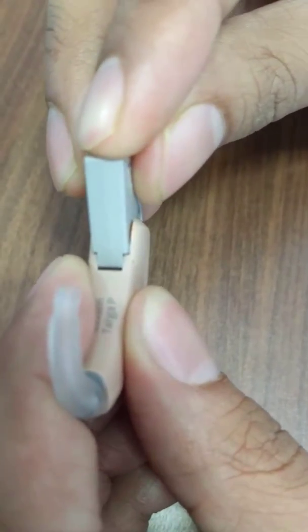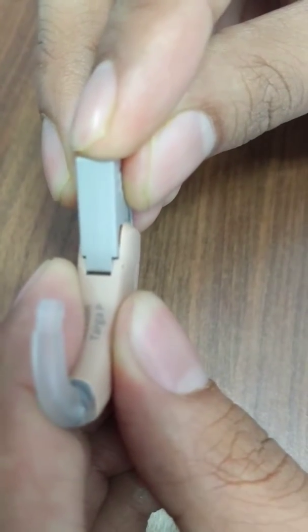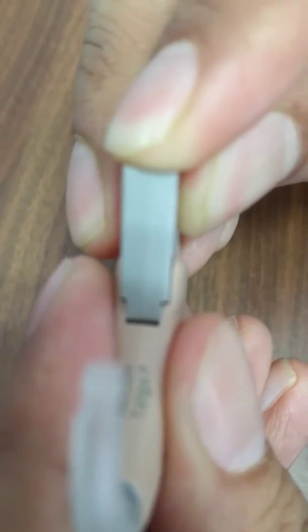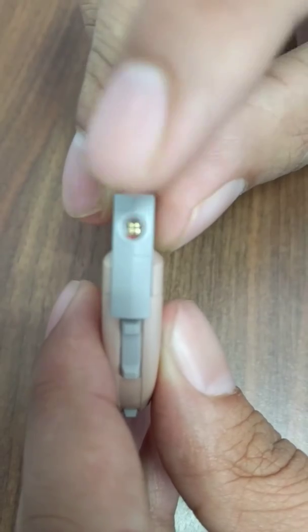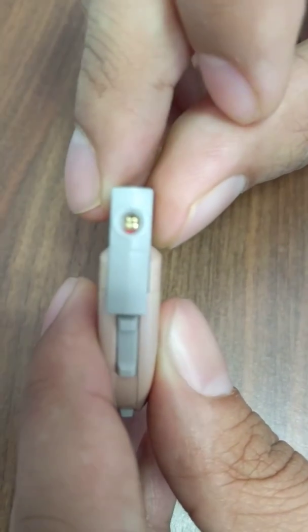At 45 degrees, just press it in and click it in — you'll hear a click sound. Hold it here and press it in. There you go — it's closed up. You can then connect your Hi-Pro cable over here. That's about it, thank you.